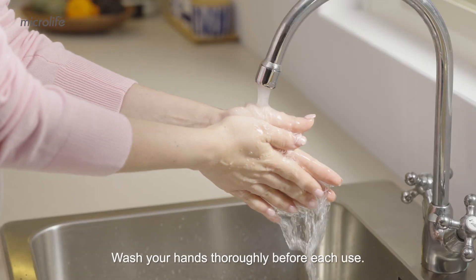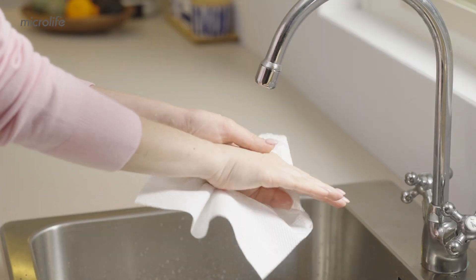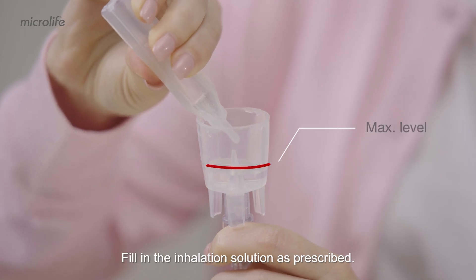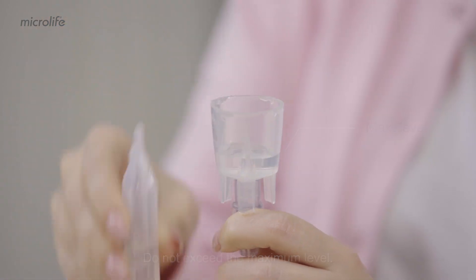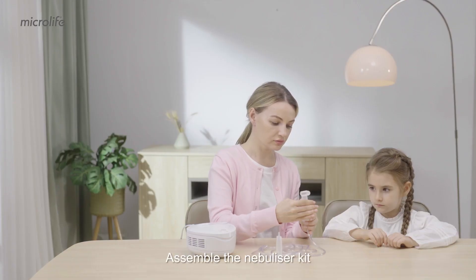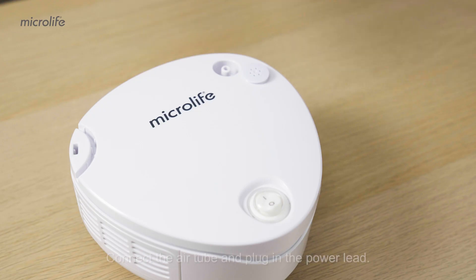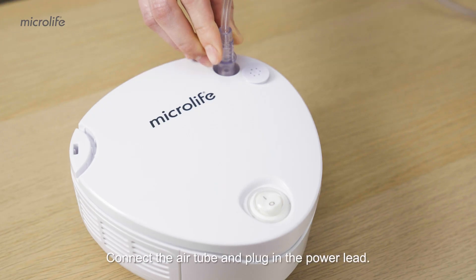Wash your hands thoroughly before each use. Fill in the inhalation solution as prescribed — do not exceed the maximum level. Assemble the nebulizer kit and make sure that all parts are complete. Connect the air tube and plug in the power lead.